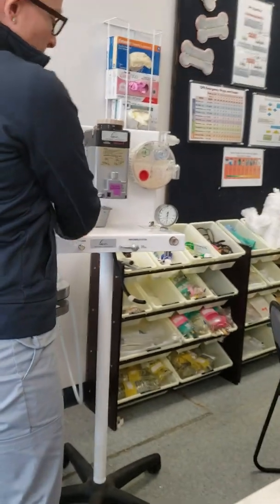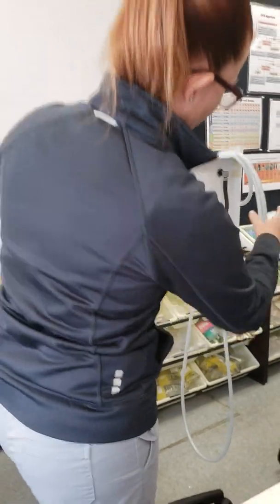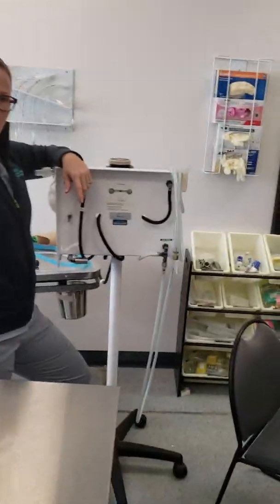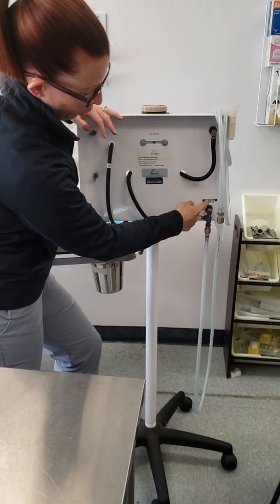Show you the back of it too. So for this one, we can actually see where everything comes. So this is our central line that comes from our pressure reducing valve, right? Comes down through here and goes into the back of our flow meter.